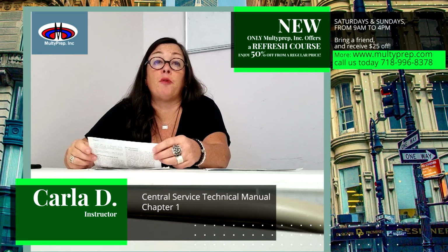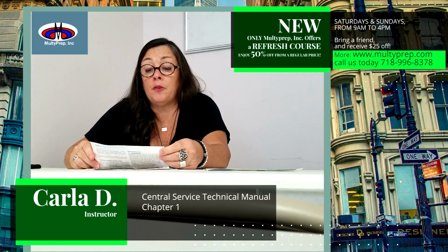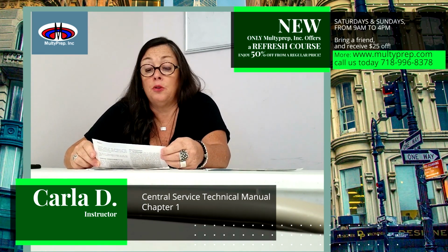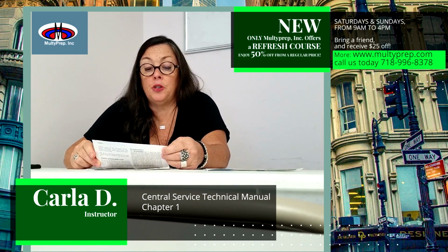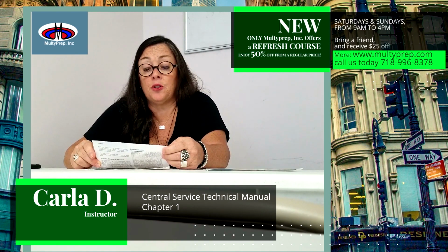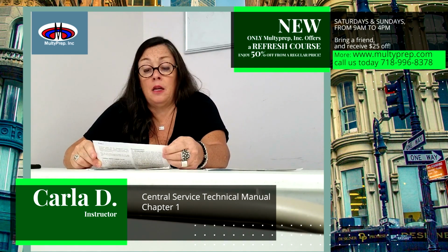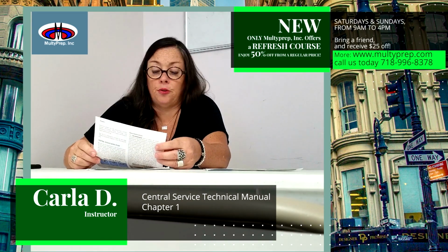Minimally invasive procedures defined: a surgical procedure done in a manner that causes little or no trauma or injury to the patient. It is often performed through a cannula using lasers, endoscopes, or laparoscopes. Compared with other procedures, minimally invasive procedures involve small incisions, less bleeding, smaller amounts of anesthesia, less pain, and minimal scarring.